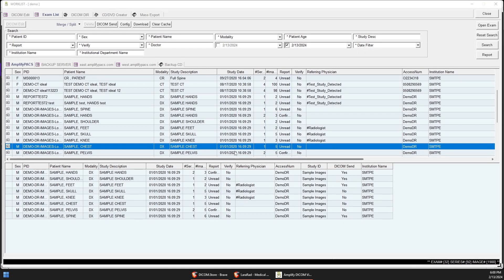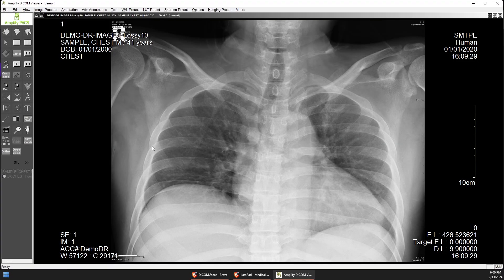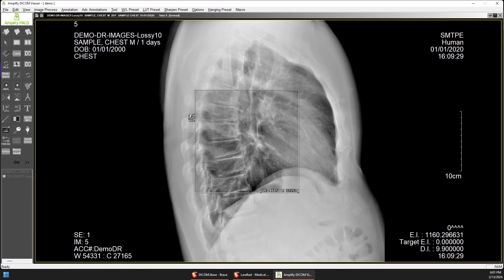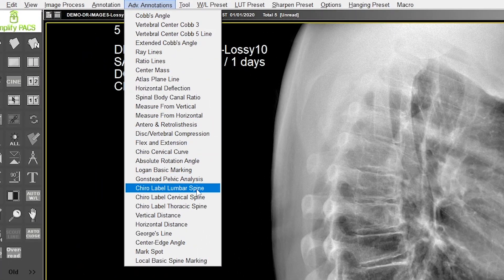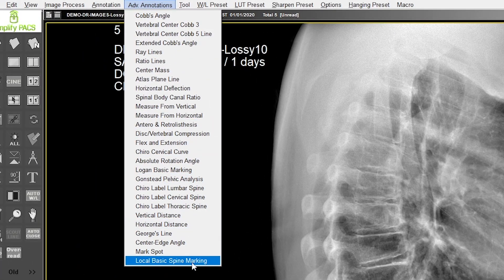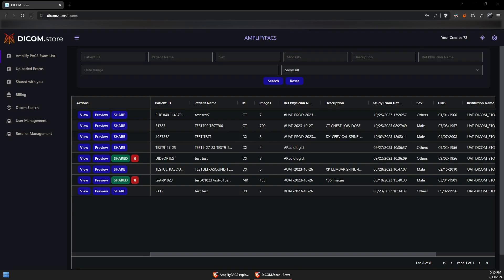Here's a quick demonstration of the viewing software that's included with the subscription. You can install it on any computer and access it from any location. There's an extensive list of tools that you can use to make measurements and markings on your films.